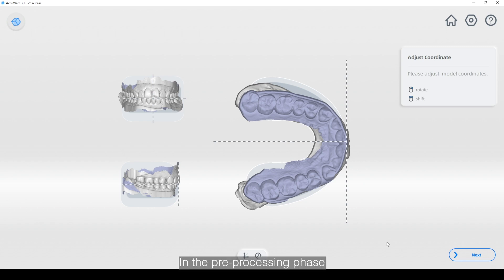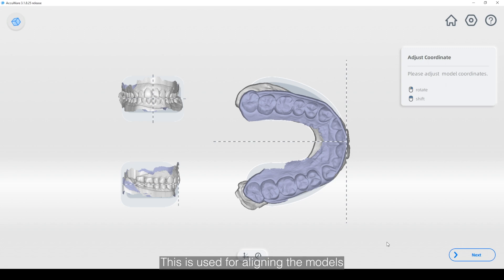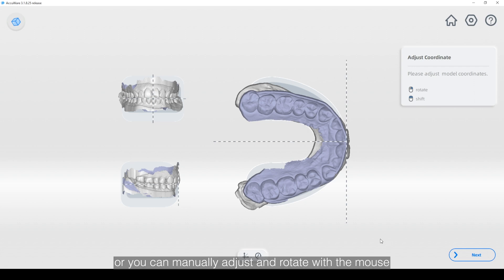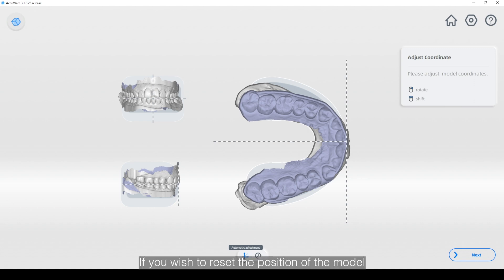In the pre-processing phase you will have the ability to adjust the coordinates of your scan data. This is used for aligning the models. There's an automatic alignment function in the bottom center of the screen, or you can manually adjust and rotate with the mouse. There's an undo button as well if you wish to reset the position of the model.